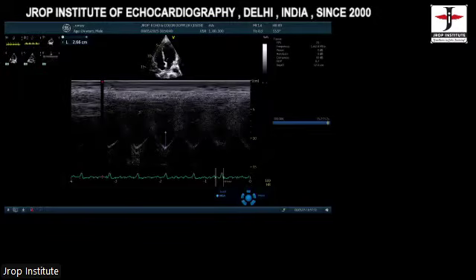Sir, if there is a ventricular septal defect, then how can we measure LV function by the Simpson method? We do the same thing as we do without VSD. Only fact is your ejection fraction may be variable because you have got two outlets. But measurements remain the same.